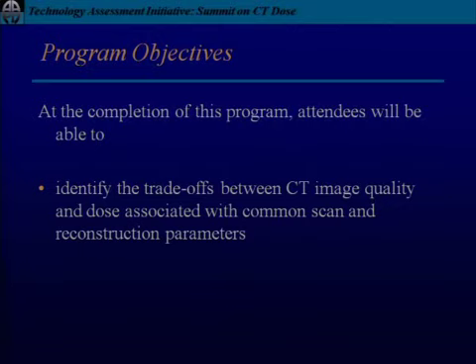During our recent application for implementation of adaptive statistical iterative reconstruction, we were advised that many neuroradiologists do not tolerate the typical levels of 30 to 40% ASIR for head CTs, and we implemented 20% ASIR, and then were asked by our neuroradiology section to reduce that because they were unhappy with the effects on the image quality.